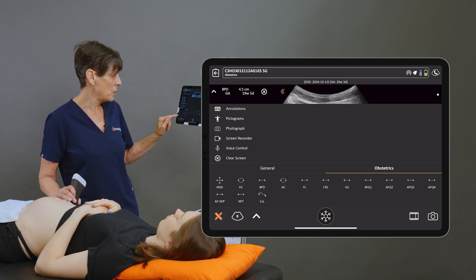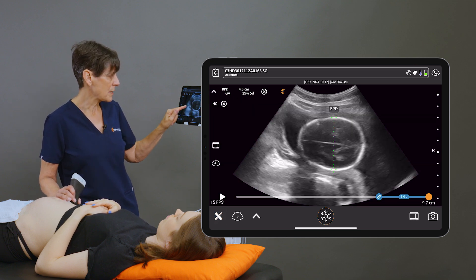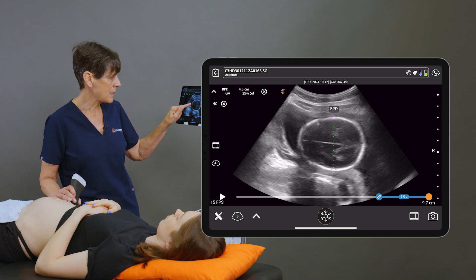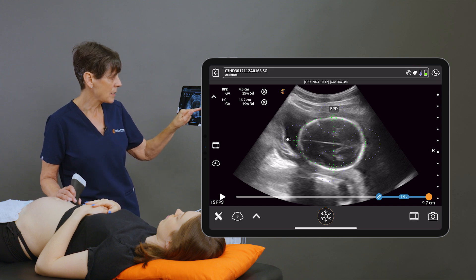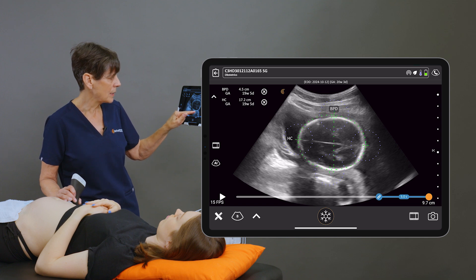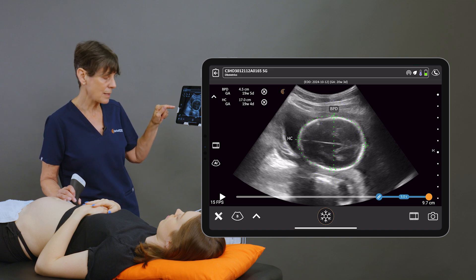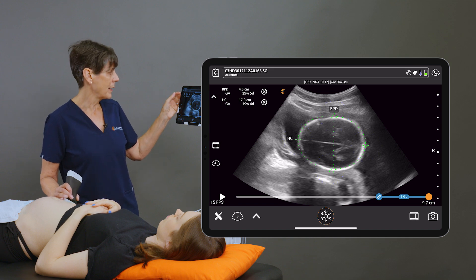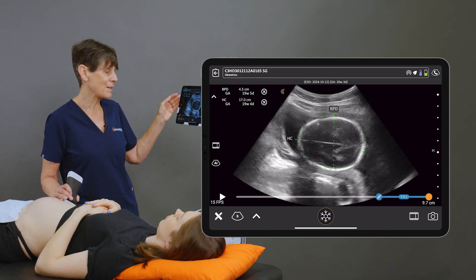On this view I can also do a head circumference. I'm going to place the calipers anteriorly and at the occiput, then adjust the ellipse until it's surrounding the skull. This is corresponding to 19 weeks and four days.